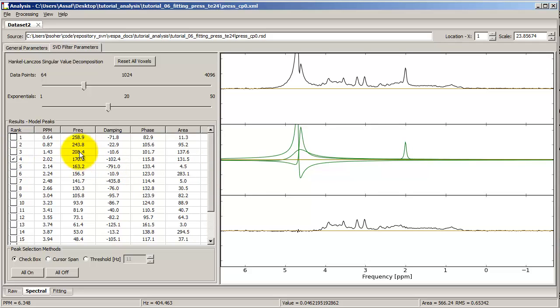And I can try and maybe filter out the lipids. You see there are some lipids here, I'm guessing at 1.43 and some unknown resonances below that. So let me check these out. See, I can just tick them, and it kind of recognizes the lipids here to the right of the NAA and does a good job of removing them in the spectrum. Well, let me untick the NAA. See, NAA is back in the spectrum now, and our spectrum looks somewhat nicer.